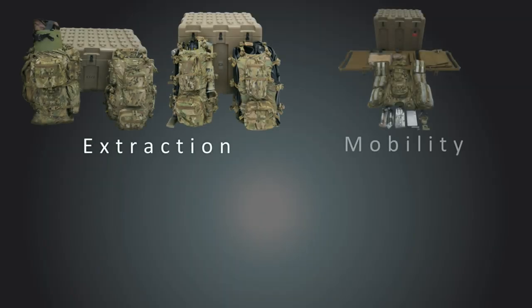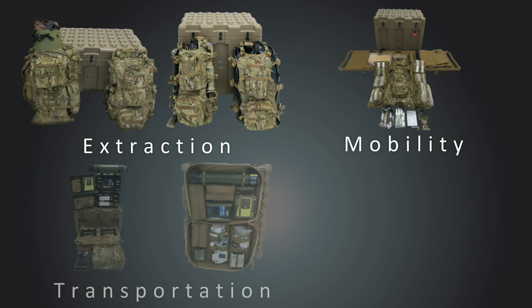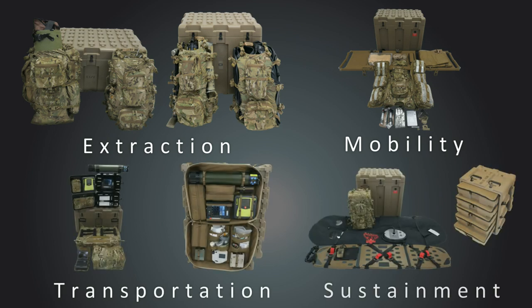The CASVAC set is separated into four performance categories or kits with subset modules. These four performance categories are extraction, mobility, transportation, and sustainment.